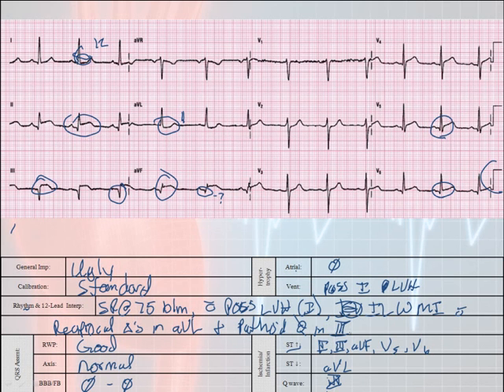And the reason I do that is because, God forbid, the 12 lead gets lost, and then I have to go sit in front of a board and justify my treatment plan. If I have a 12 lead that I can look at, then I'm going to say, oh, well, this is what I saw. But what happens if I don't have that 12 lead?